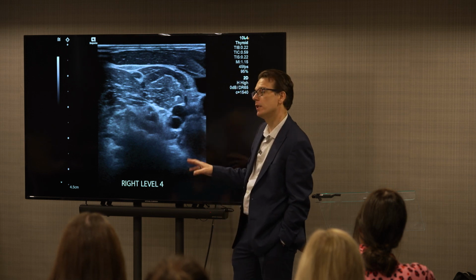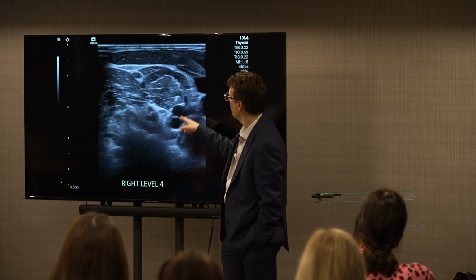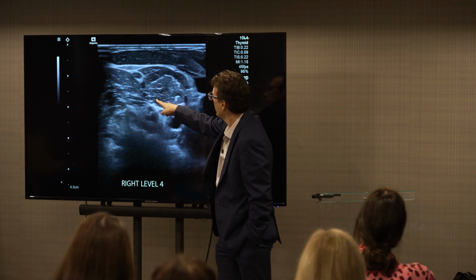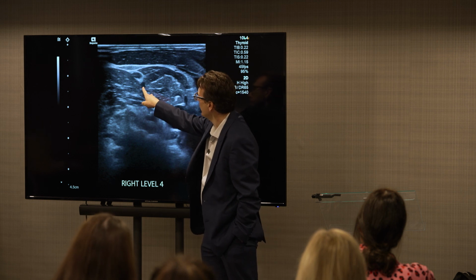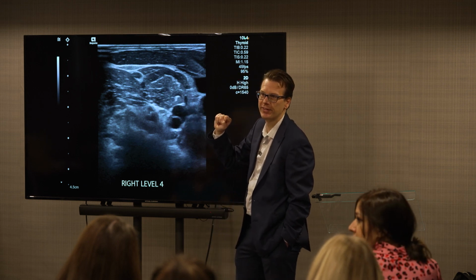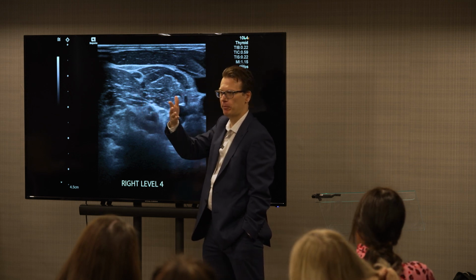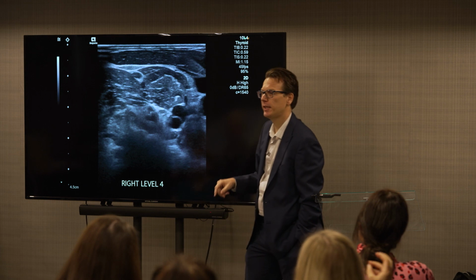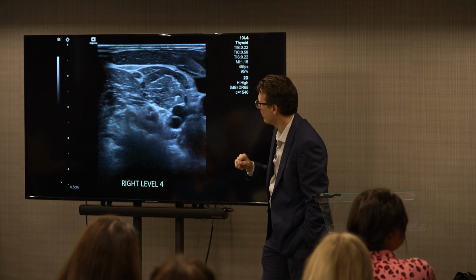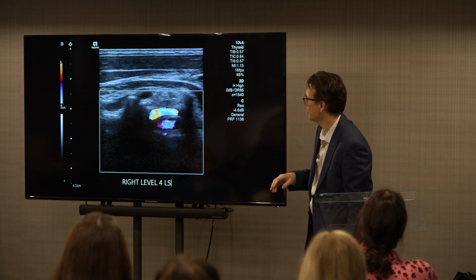So you can also see other things. With ultrasound, you can see most things in the neck. So with this, again, here's your carotid and internal jugular vein. Here is your scalene anterior, and if you can see these 3 dots here, does anyone know what these might be? Here's scalene medius. Brachial plexus, yes, these are your brachial plexus trunks. Okay. So we try again, sternocleidomastoid muscle here. Okay. And if you're not sure, you can always put the coloured Doppler on, and that'll show there's no flow.